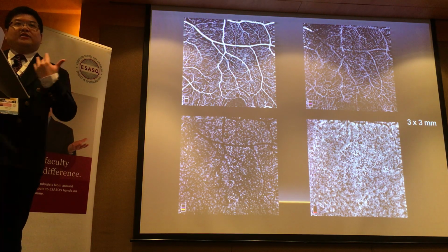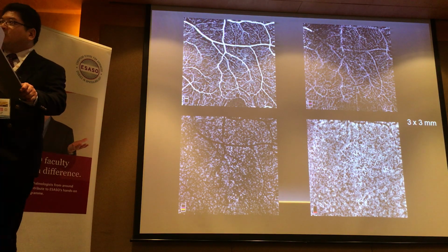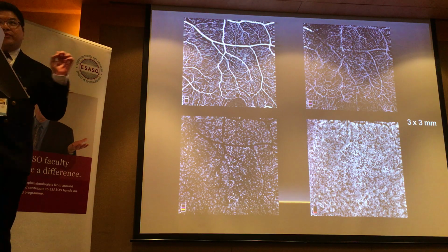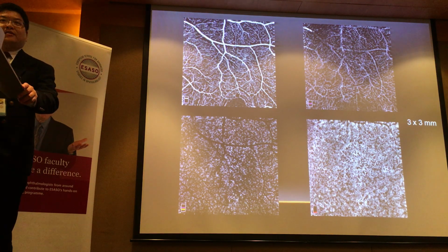So you're using this to help you get more information. As I'll mention later, multimodal imaging, by its name, tells you how important it is. And even with OCT, one of the pitfalls is, do not rely just on OCT. There's no need to rely on just one modality.